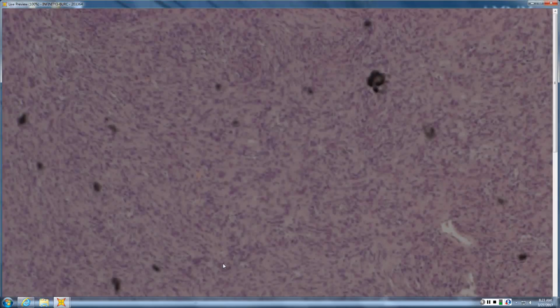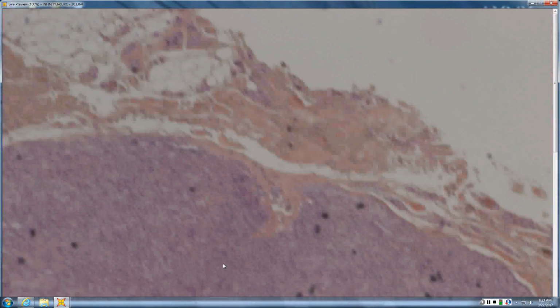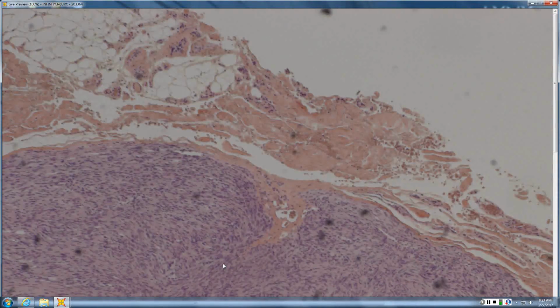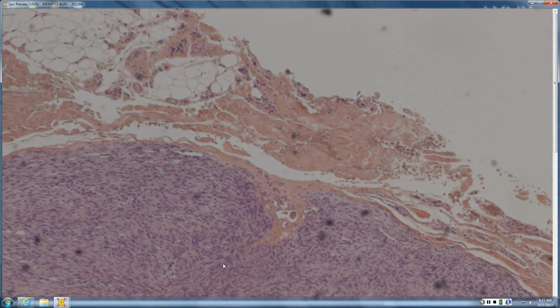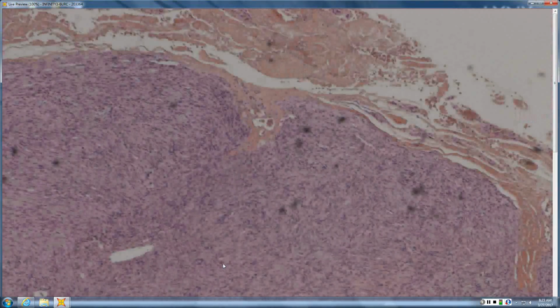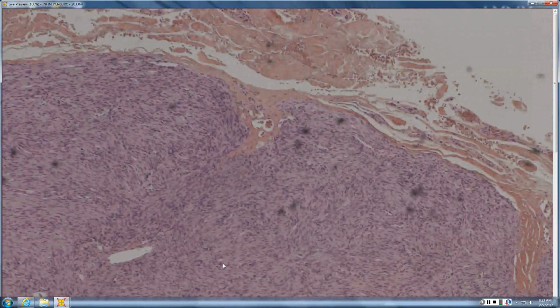I would go down a much broader differential. I can see that some things here are concentric, and some are myxoid. There are soft tissue perineuriomas that look different from what we usually see in skin. I think you had one in the fellow unknowns, but I would definitely walk through immunostains for this and get a consultation. Doesn't look like the ones we see in skin.